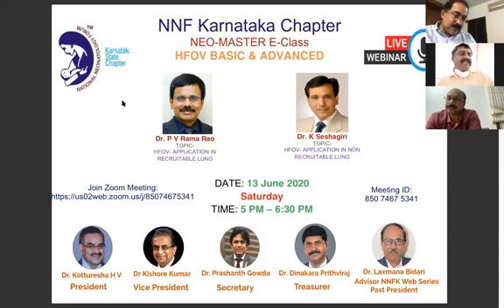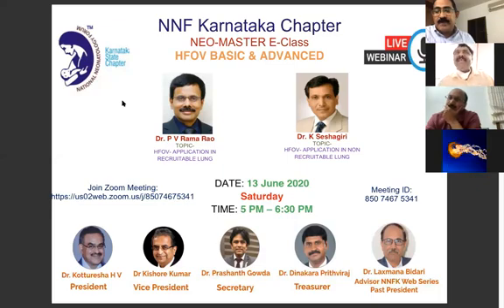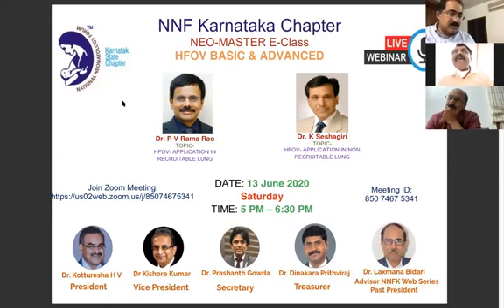Yes. So Dr. Siddharth, I think you understood from MP. What sir told is very clear, but only one word you have to remember. What is the difference between conventional ventilator and HFOV, Dr. Siddharth? Only thing is there PEEP we do use. Here MAP is there because in CMV also MAP is there. The same thing what we will do, we are expanding the lung, Dr. Siddharth, just above the FRC.